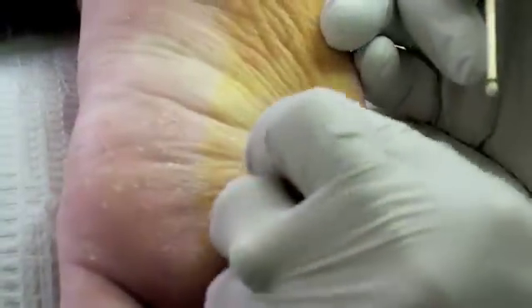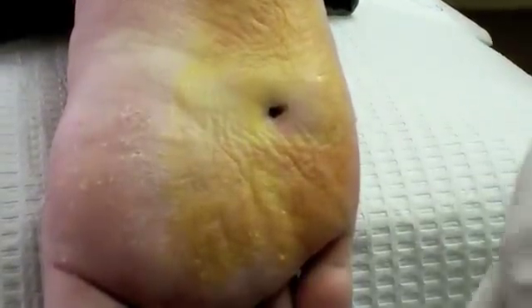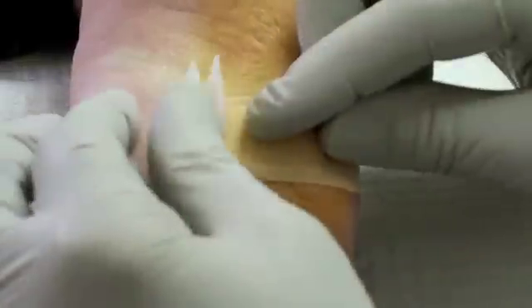And that looks pretty good. That's what we have left. Cover it with a band-aid and some antibiotic cream, and he's all set to go home.